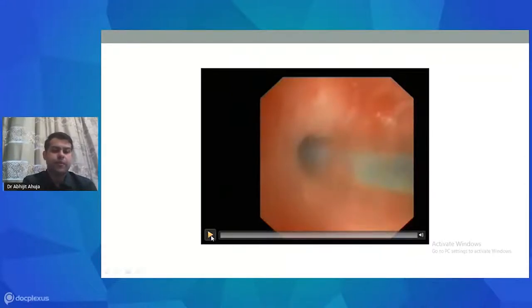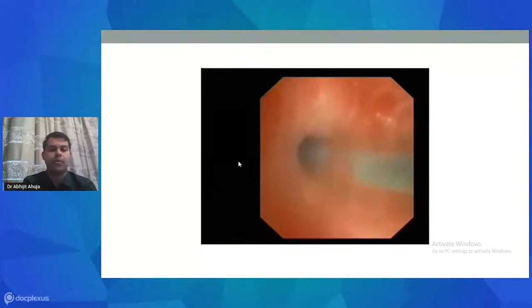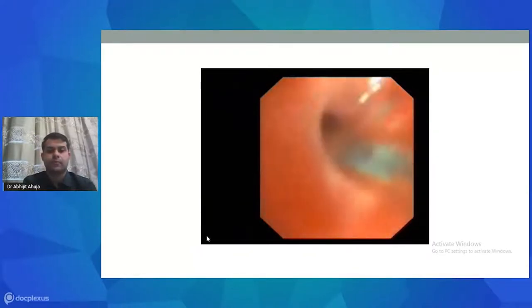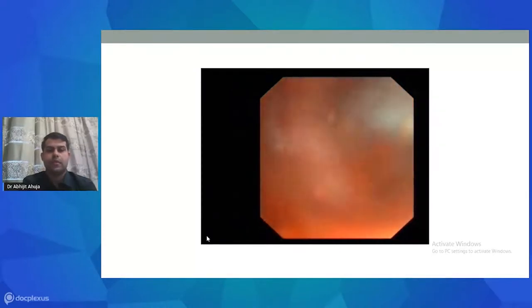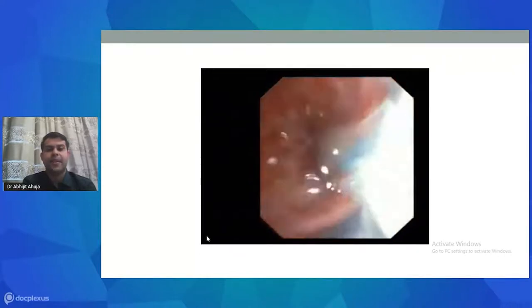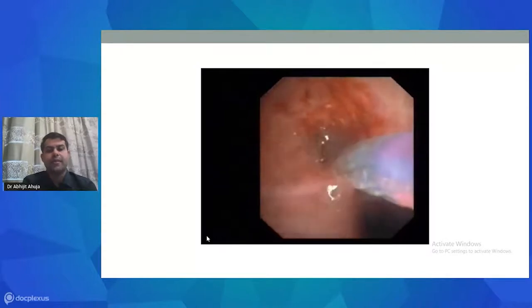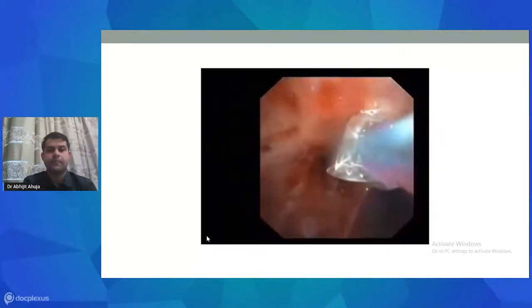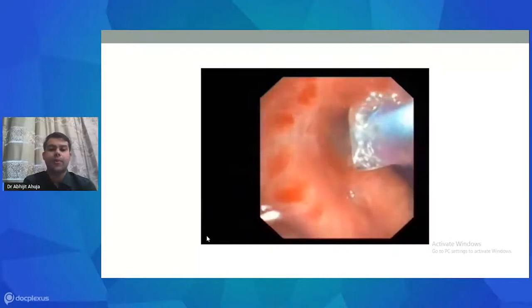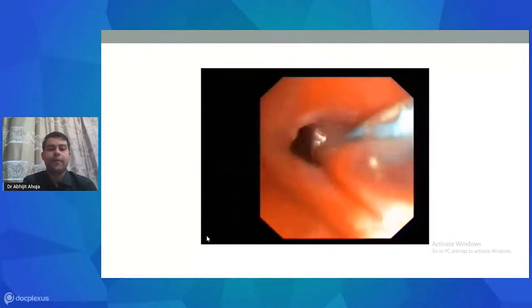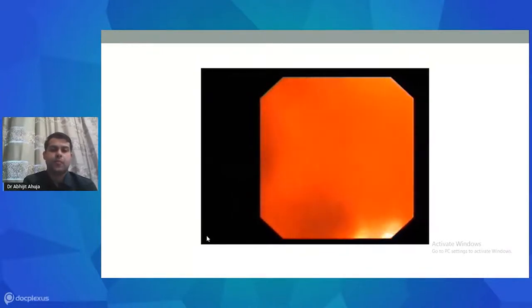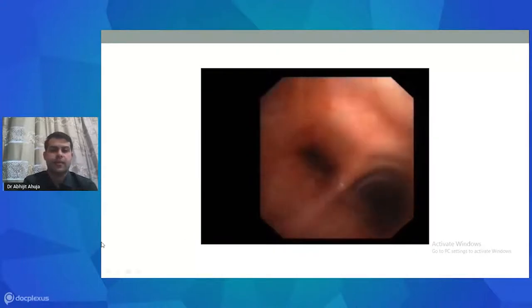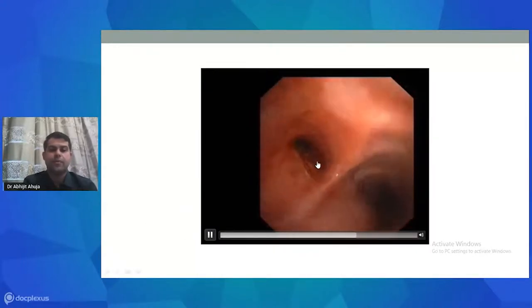Here is a video demonstrating balloon dilators being passed through the stenotic segment. The entire balloon has been advanced through the stenotic segment of the left main bronchus, which is clearly stenosed, with saline instilled into the airway. The balloon has been inflated and held for approximately 30 seconds to one minute, after which it is gently withdrawn. The dilatation achieved is visible to a suitable degree.